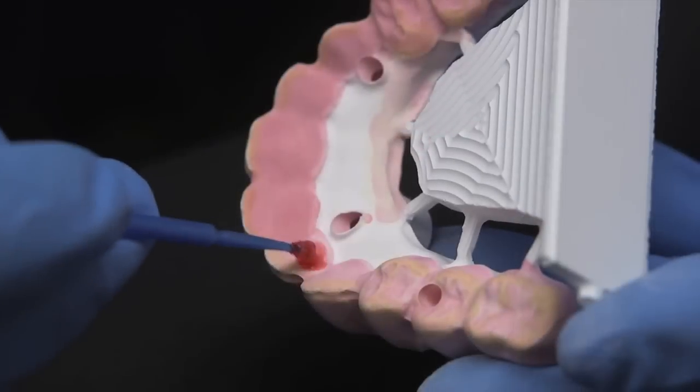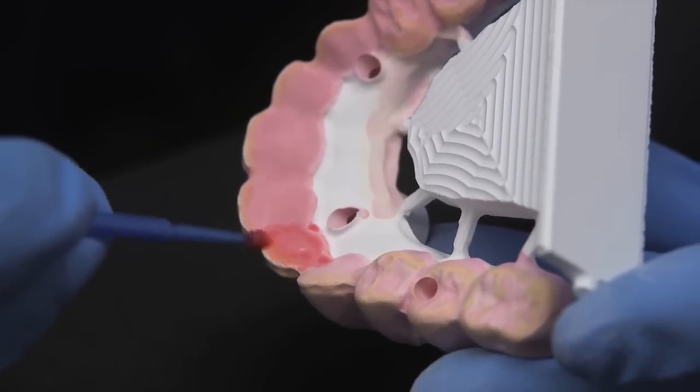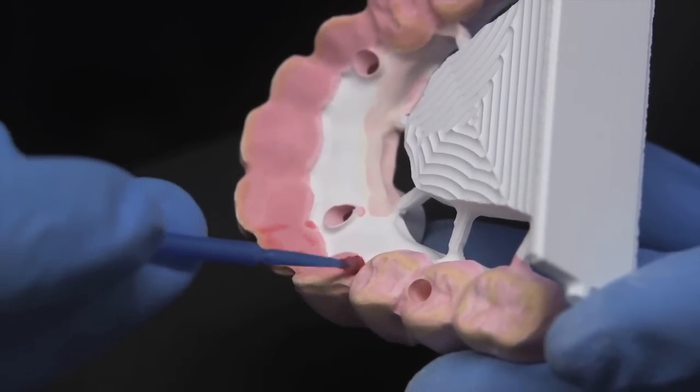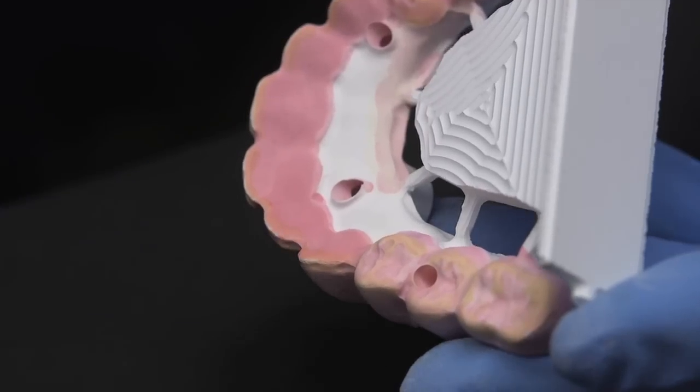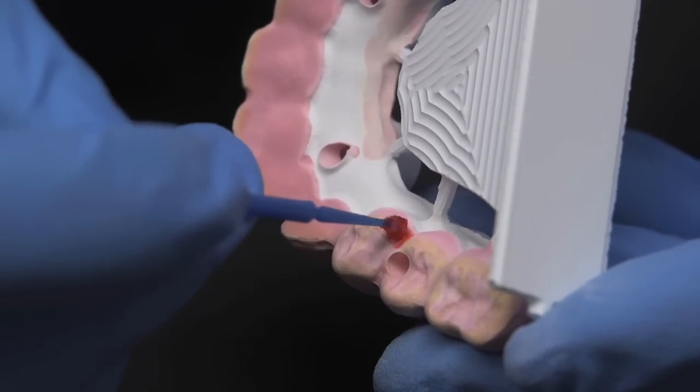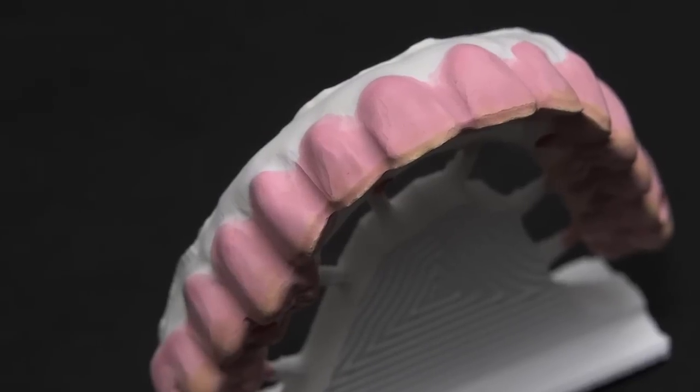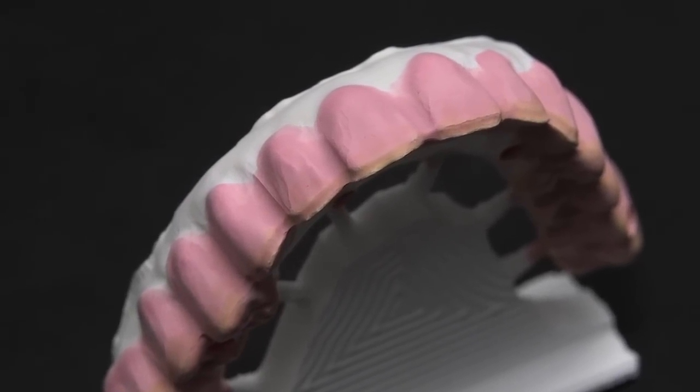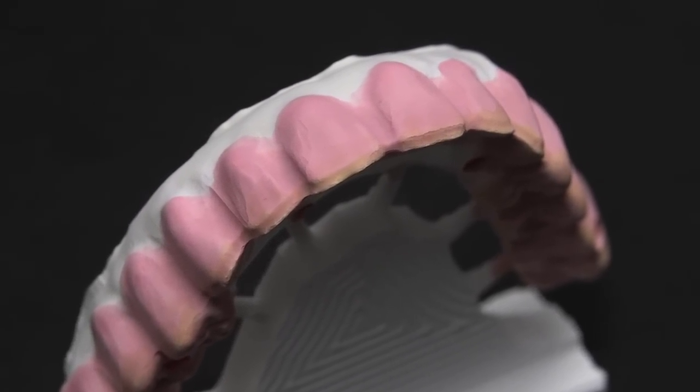You may have noticed the support bars that are attached to the lingual of the bridge. These bars prevent the bridge from warping during the sintering process. When sintering, we recommend running only two bridges per cycle to ensure the furnace is heating consistently.